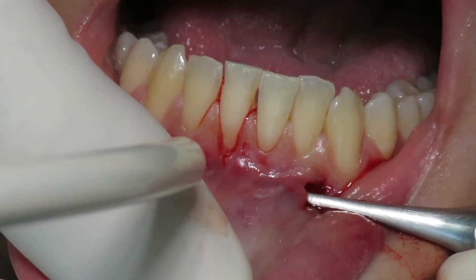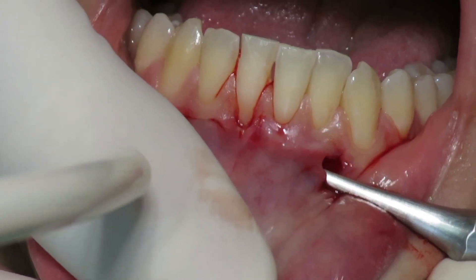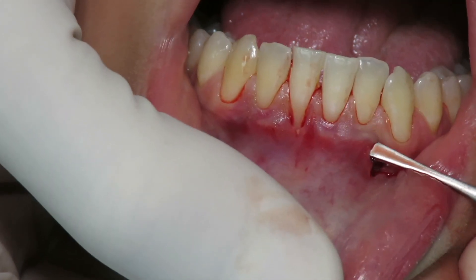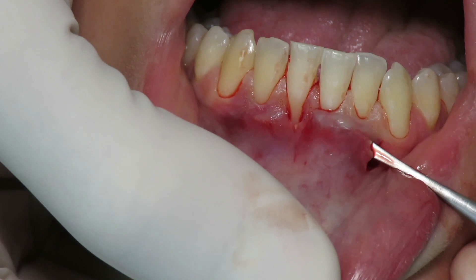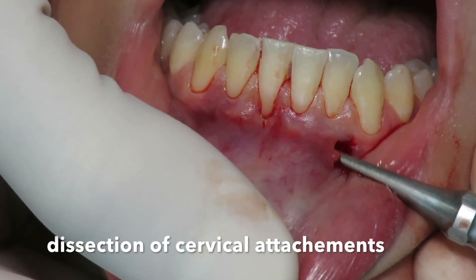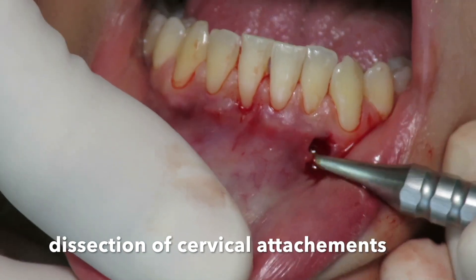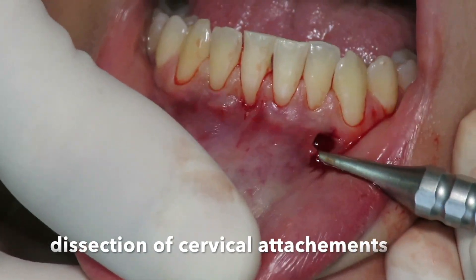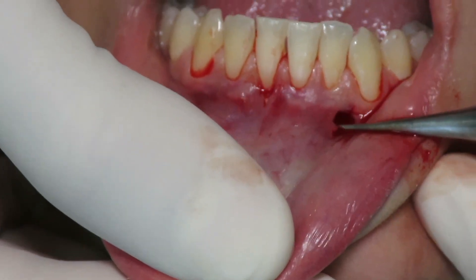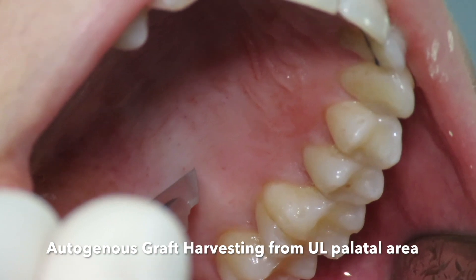Very meticulously and precisely we do the reflection of the flap. It is also important to detach the attached gingiva and dissect the cervical attachment properly in order to fit the graft into its recipient bed. Then we choose the palate as the donor site.